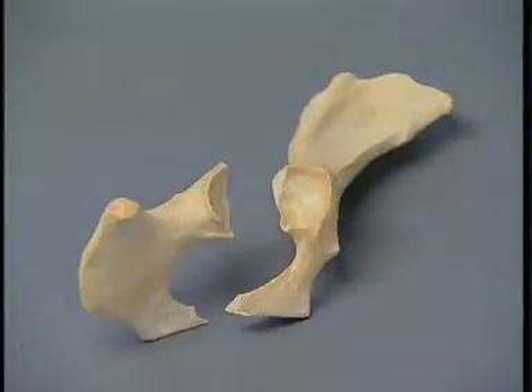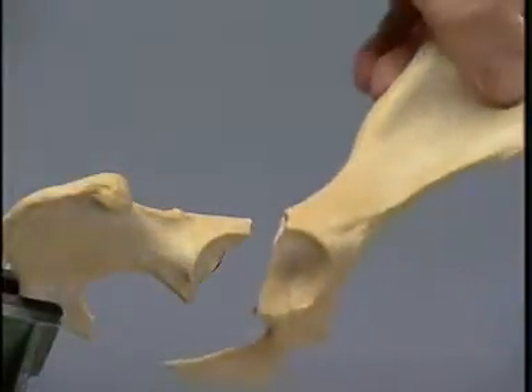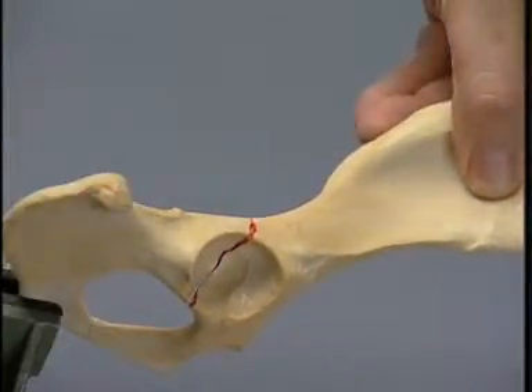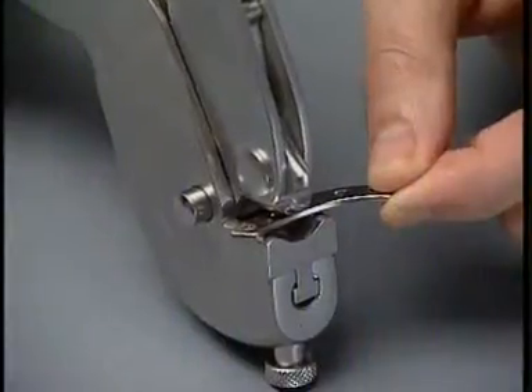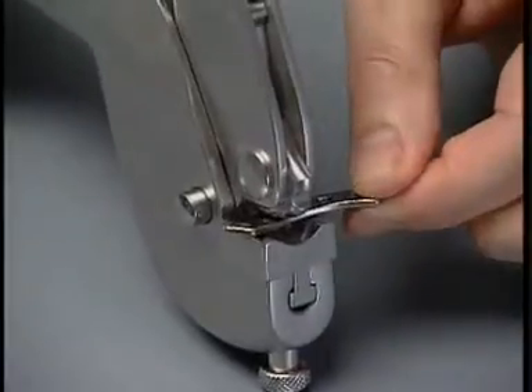This is a view of the fractured acetabulum. Secure the caudal fragment in the vise and reduce the cranial fragment to assess the contour of the dorsal rim of the acetabulum. Contour the special acetabular plate with the bending pliers to the shape of the dorsal rim.